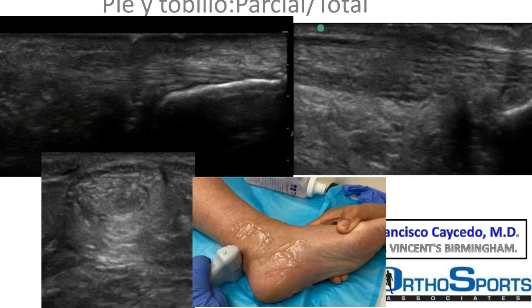And that probably explains the anatomy and the embryology of the Achilles tendon. Remember, the Achilles tendon doesn't run completely longitudinal. When they have the insertion, they have like a torsional insertion, very interesting, with a lateral and a medial component. So that's why there is a pattern to know what part is usually more damaged. And you can see it's like AM, in the morning, and PM, in the afternoon. So the AM usually is the one that gets more injury.